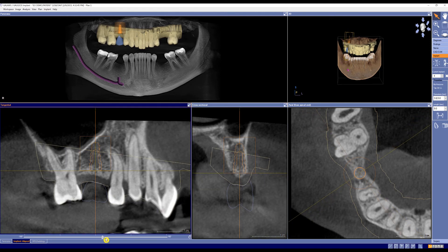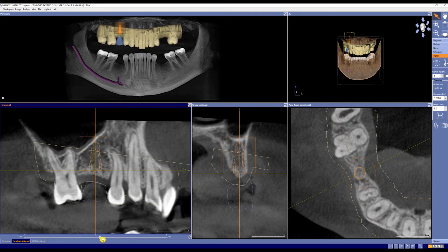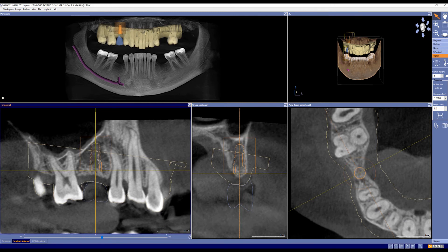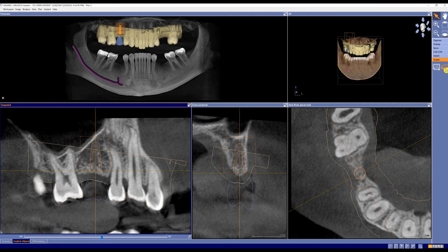We can rotate around our virtual implant and make any adjustments accordingly. From here, we can go to our Surgery tab and either have a report made or get ready for a surgical guide.